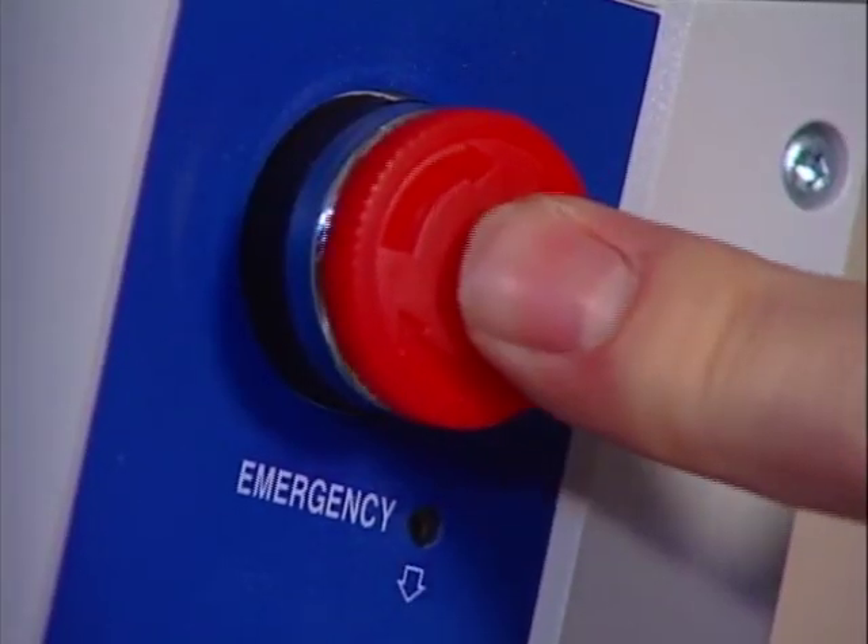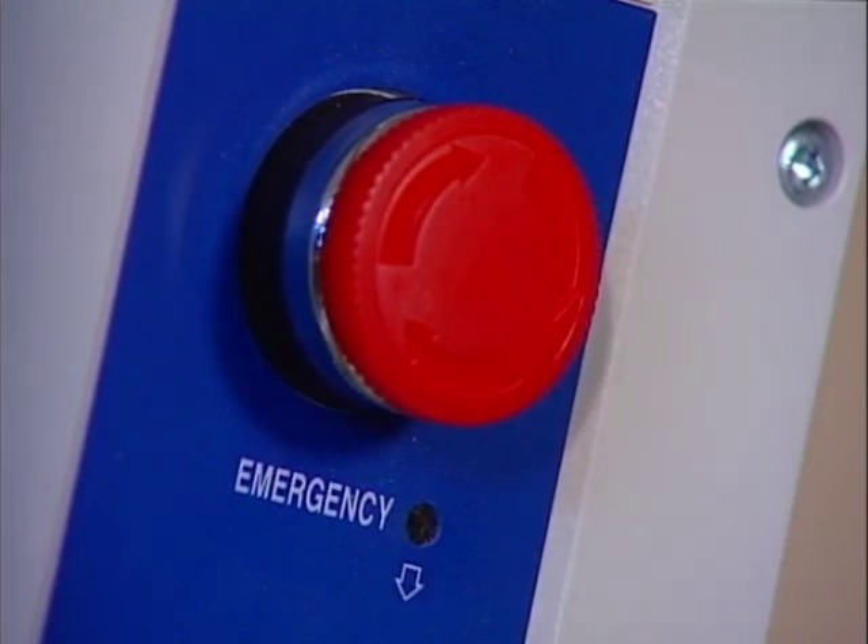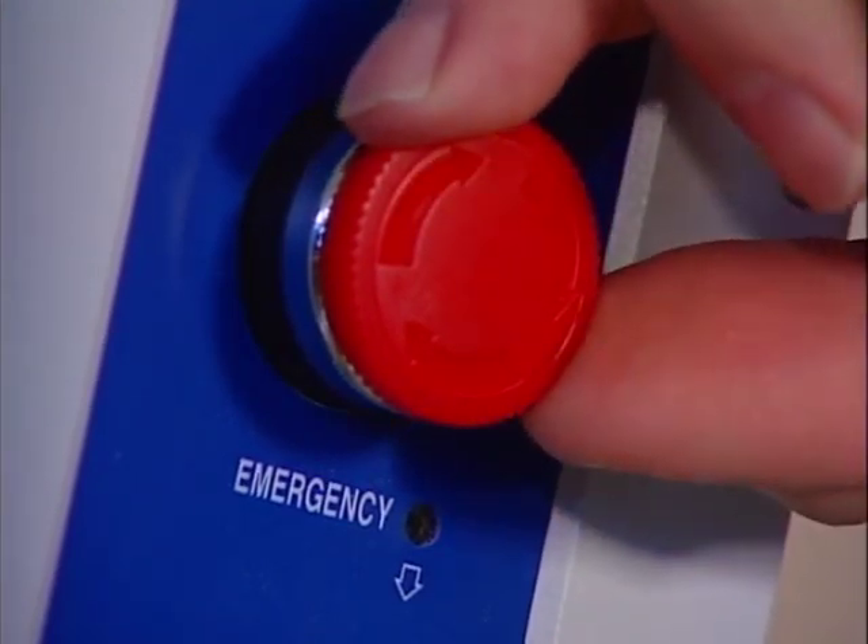If for some reason you need to shut off all power to the lift, you can deactivate it by pushing in the stop button on the control box. To restore the power, rotate the stop button to the right.